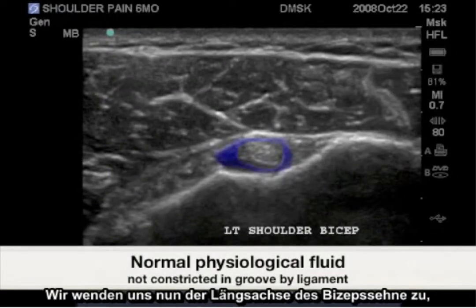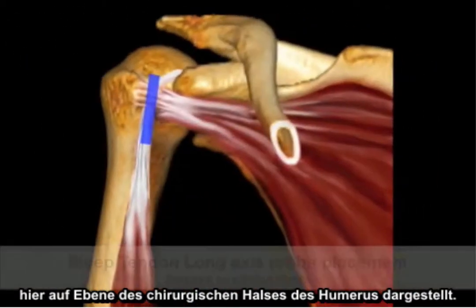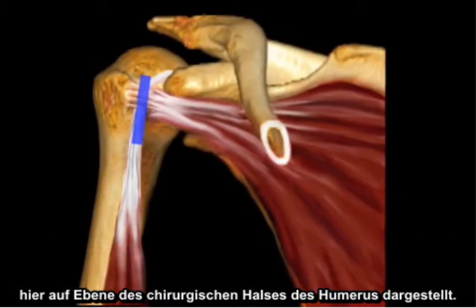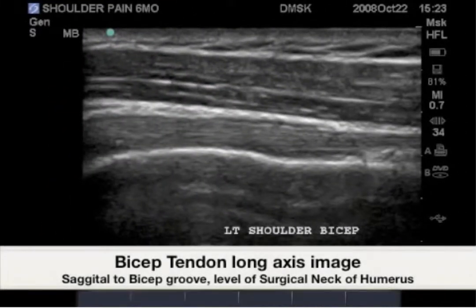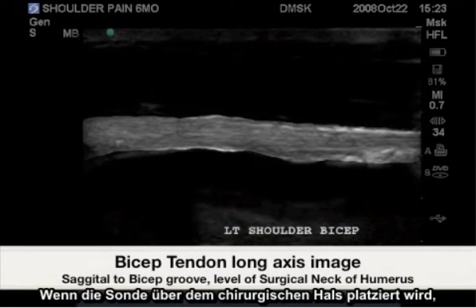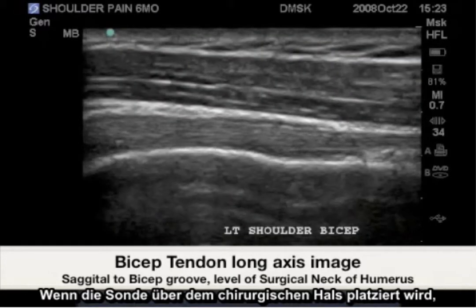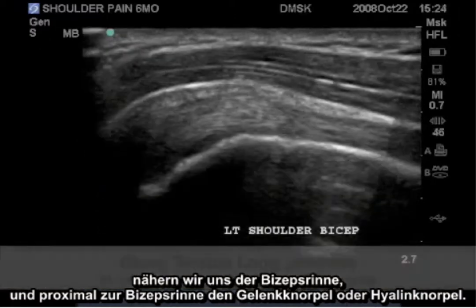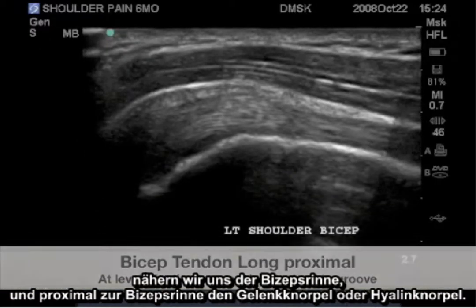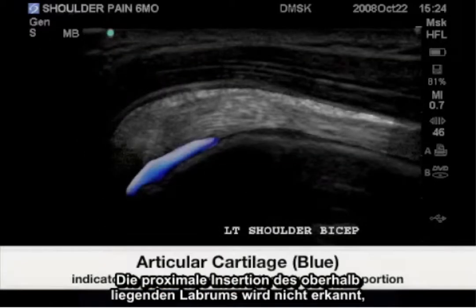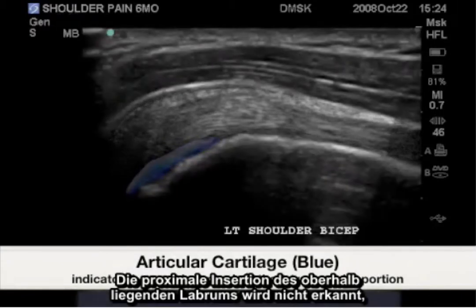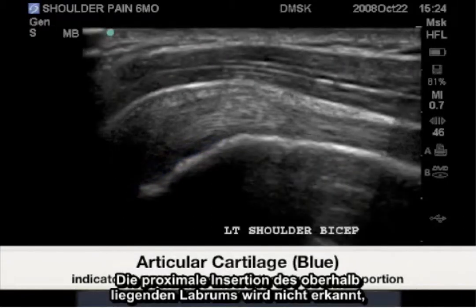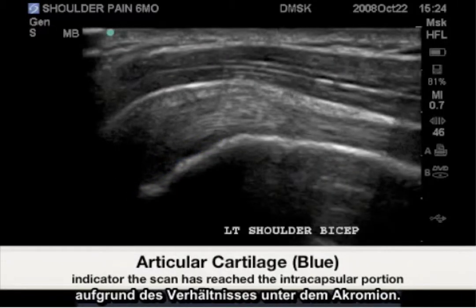We now turn to the long axis of the bicep tendon, shown here at the level of the surgical neck of the humerus. Highlighted is the bicep tendon fibrillar pattern. When the probe is placed higher than the surgical neck, we approach the bicep groove, and proximal to the biceps groove, the articular hyaline cartilage and the very proximal insertion to the superior labrum will not be seen due to its relationship beneath the acromion process.